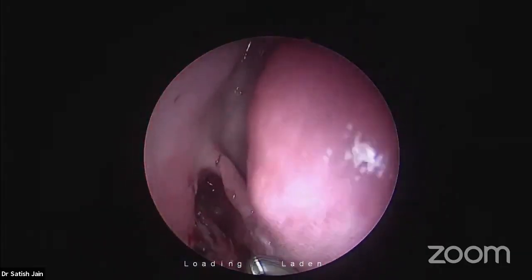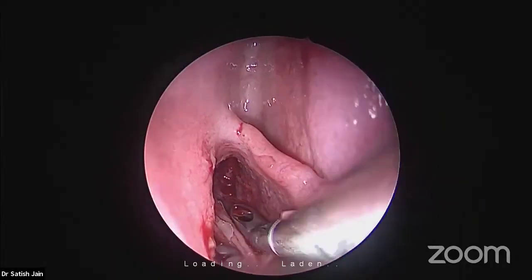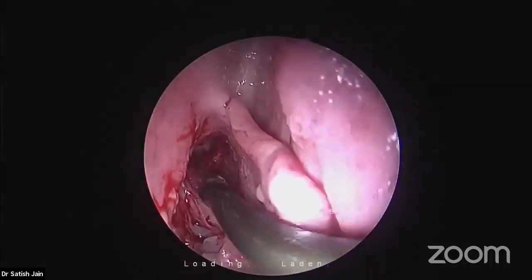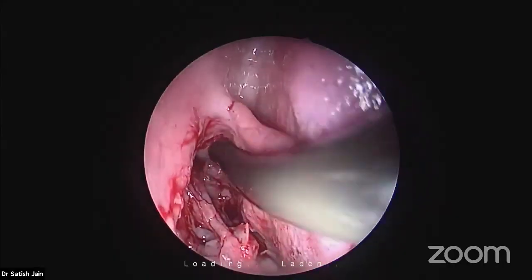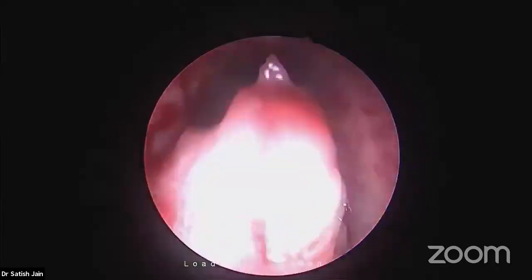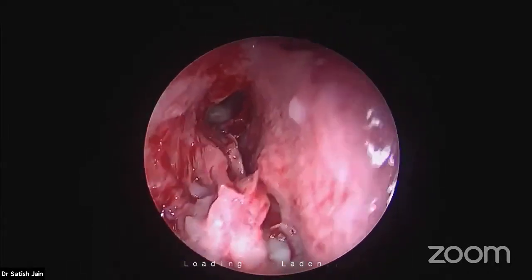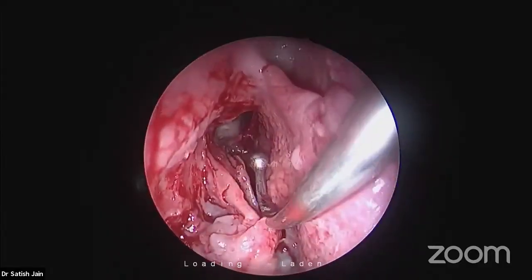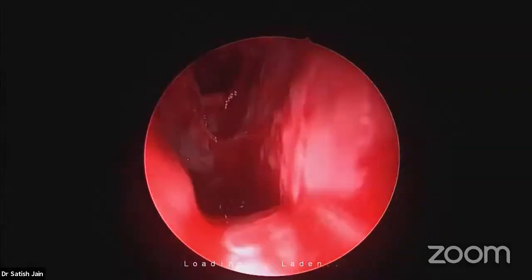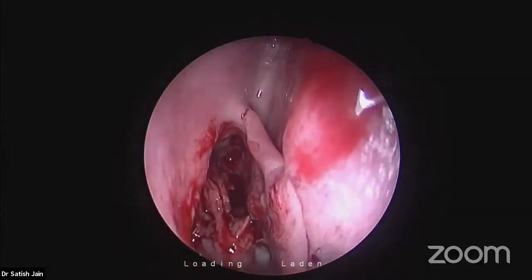Any difference between suprabullar cell and suprabullar recess? Suprabullar cell and recess are the same thing. No difference. Now, why do people call it recess? Let me tell you. I fractured the bulla to show you the anterior ethmoidal artery. I fractured this bulla to show that the anterior ethmoidal artery is behind. Let me clear that region to show you first.